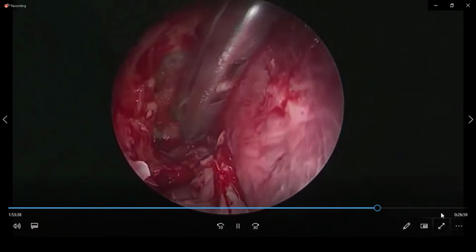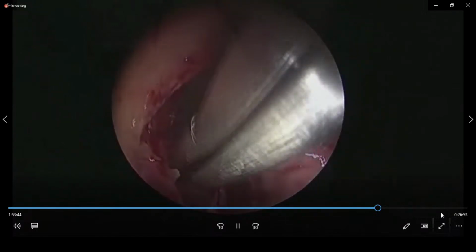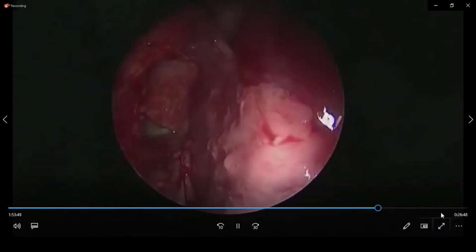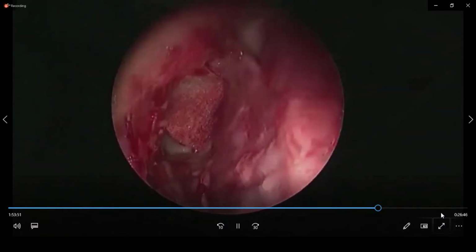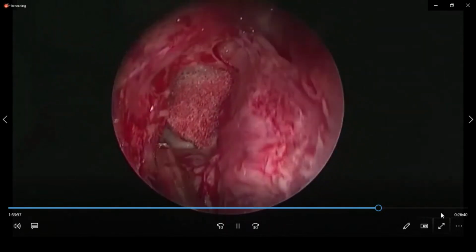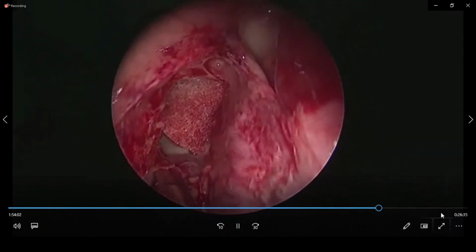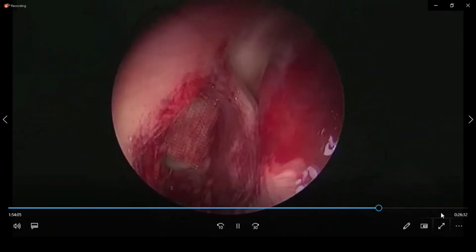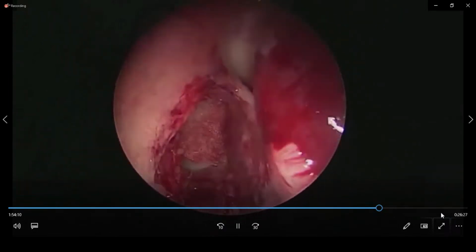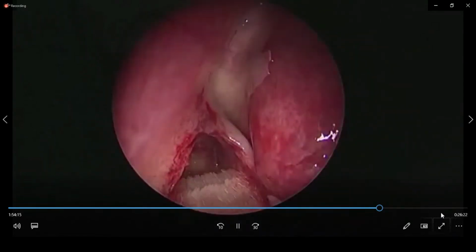Yet your anterior ethmoidal artery is nowhere in the scene. It is behind. And who is protecting the anterior ethmoidal artery? The bulla. So that's the beauty of the intact bulla technique, that as long as the bulla is intact and reaching the skull base, your anterior ethmoidal artery is always protected by the bulla. Because the bulla goes anterior to the anterior ethmoidal artery course to attach onto the skull base. With the 70-degree, keeping everything anteriorly focused, you are automatically away from the anterior ethmoidal artery trajectory.